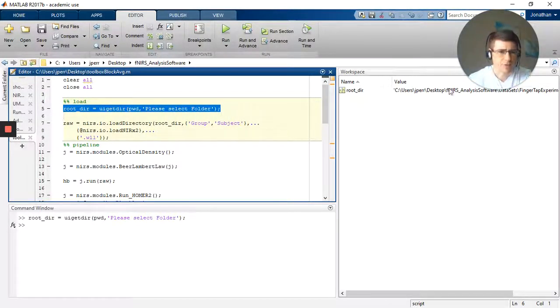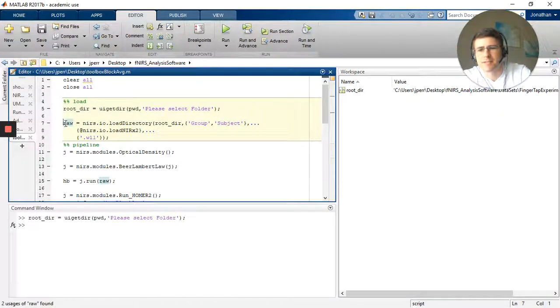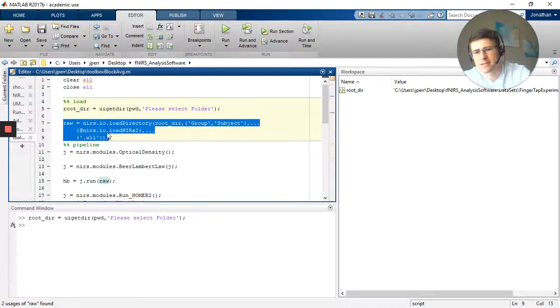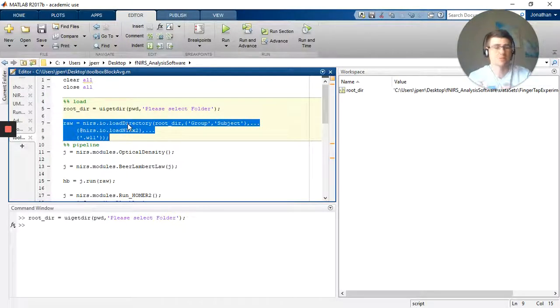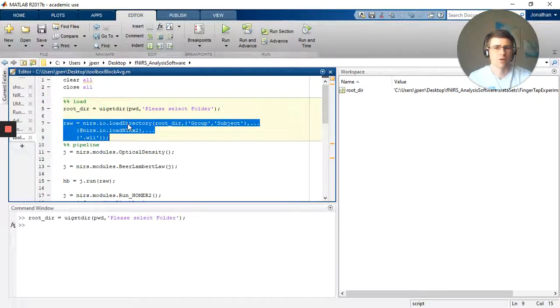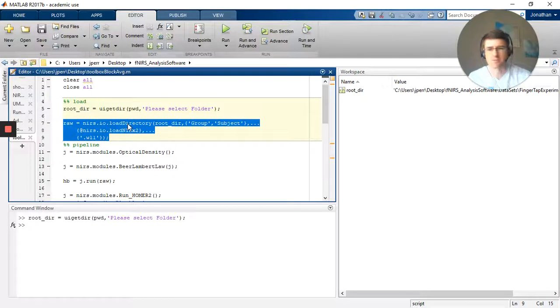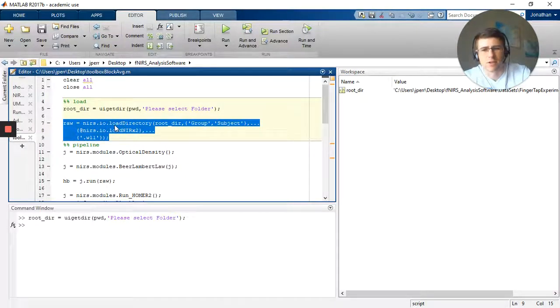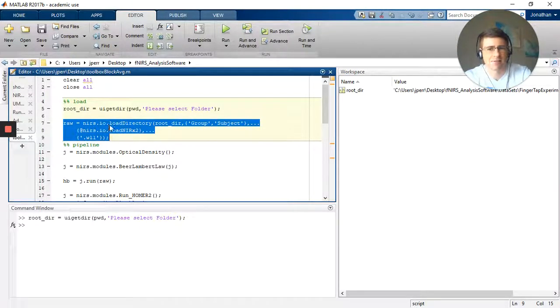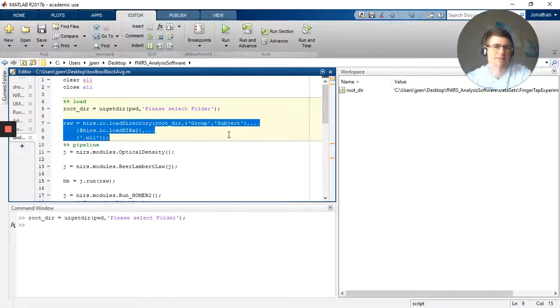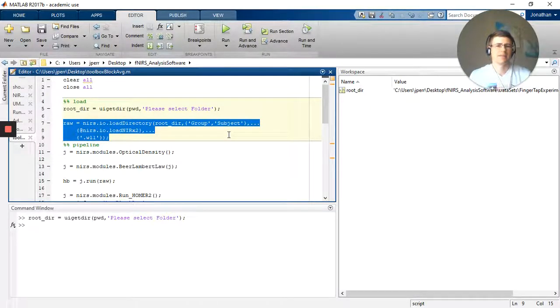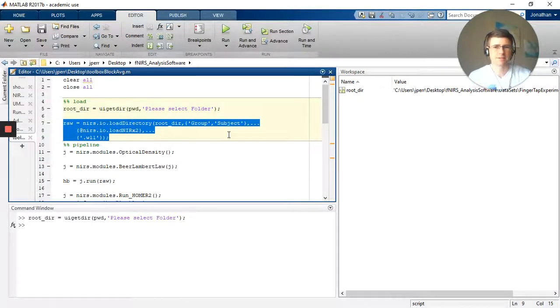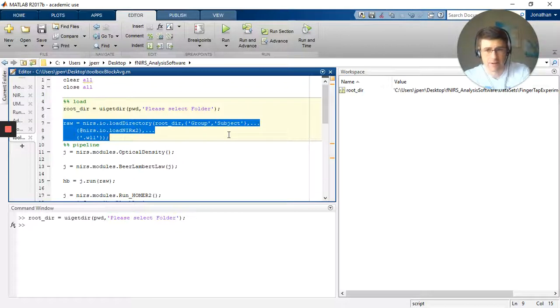You'll see the root directory appear here. The next step is to use a NIRS toolbox function. And at this point I've already added NIRS toolbox to my file path. I've also added Homer2 to my file path. You will need, and it's specifically the source code for Homer2, which is available on the normal download site for Homer2. You'll need both in order to actually call these functions. So I'm going to use the load directory function, which is in the NIRS folder and the IO subfolder. I'm going to use the root directory that I just selected. This is a little redundant, but it's basically saying it's a folder hierarchy, and if I open the first folder I see it's going to be called group, the next folder within that I'm going to call subject. I only have one folder so it's not going to really matter here.